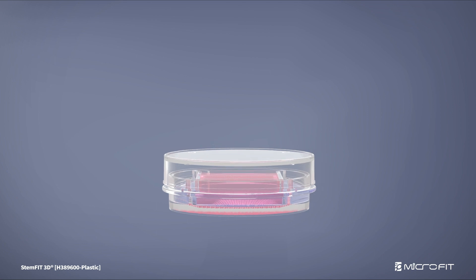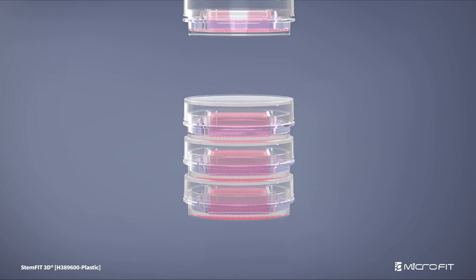Lastly, StemFit 3D is designed to be stackable, and researchers can move plates reliably and stack them neatly.